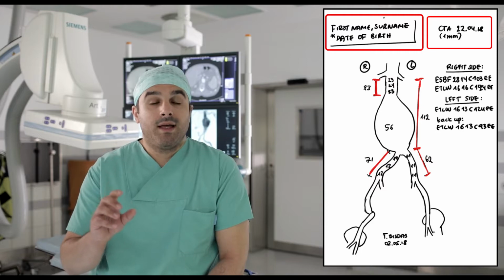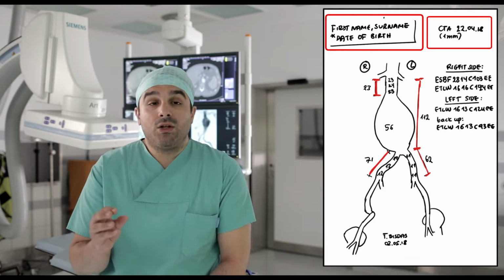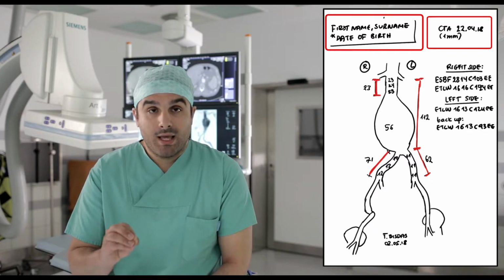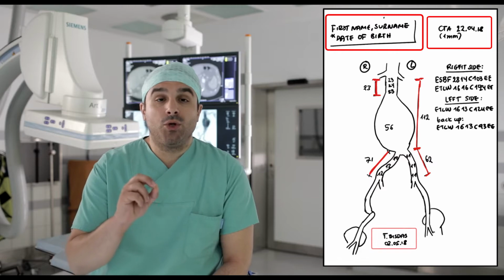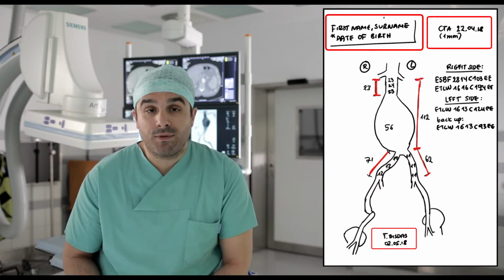Keep in mind, the drawing should include all important information in order to have all in one document before implantation. Moreover, your signature and the date of measurement are important for everybody in order to know when this procedure was planned and who is responsible for this planning.